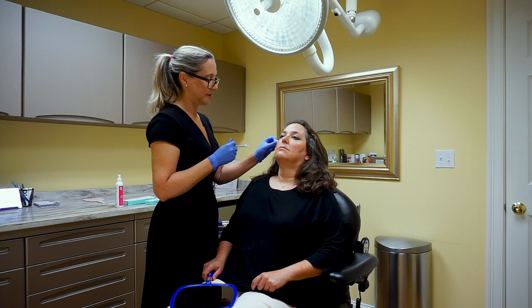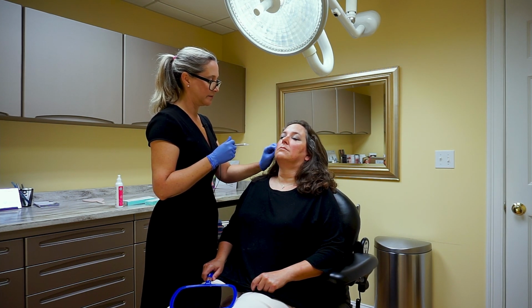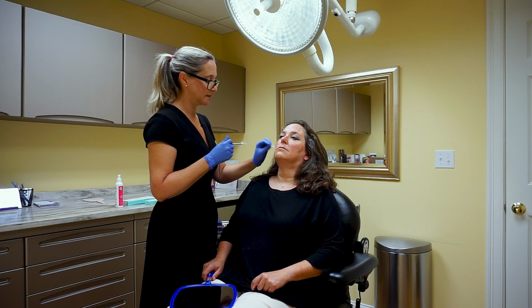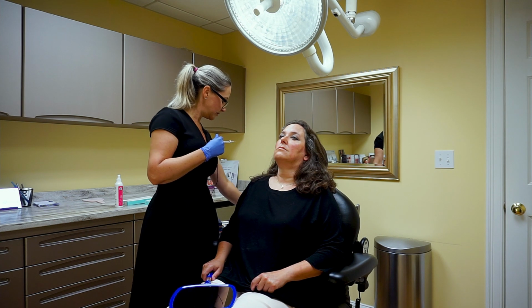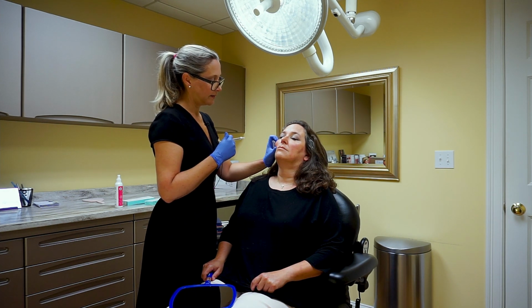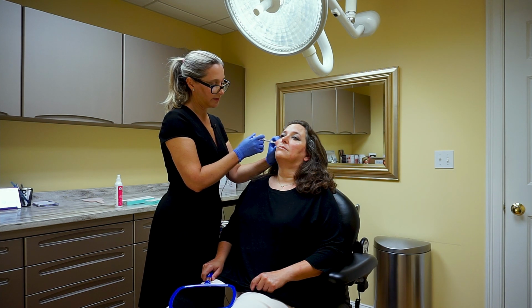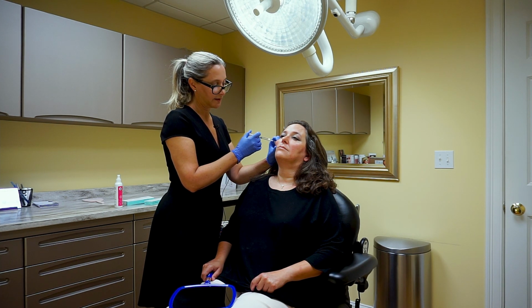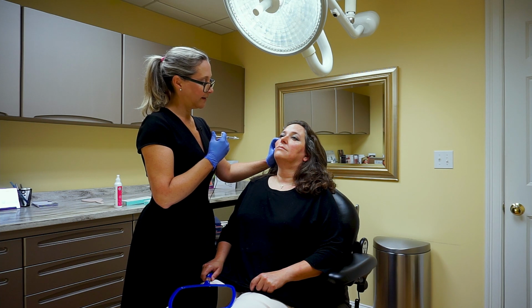So I want to make sure that the skin's nice and clean. We cleaned off Jody's skin before we started any of this. And I'm just going to lift the cheek where I want it to be and just inject. I start with just real depot injections that I think of as kind of a peg that I'm hanging my coat on. And I'll let it sit up here.